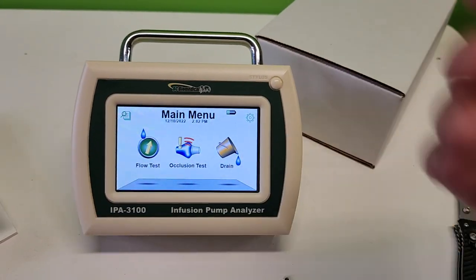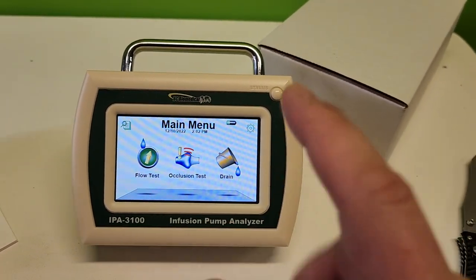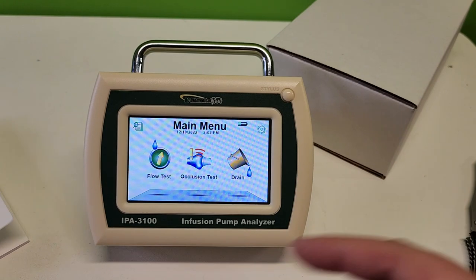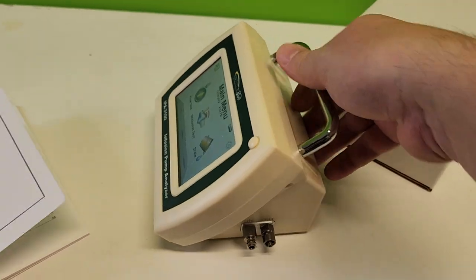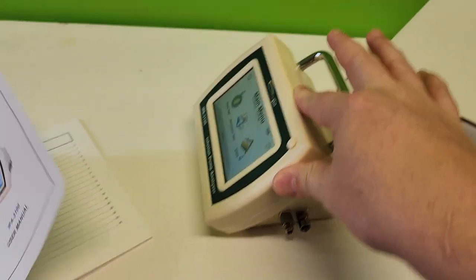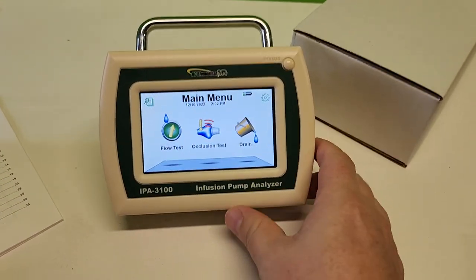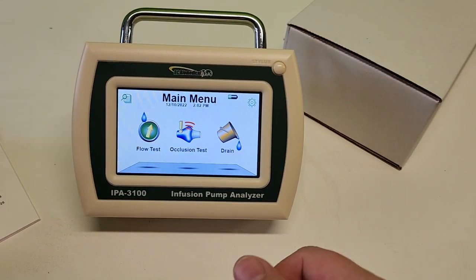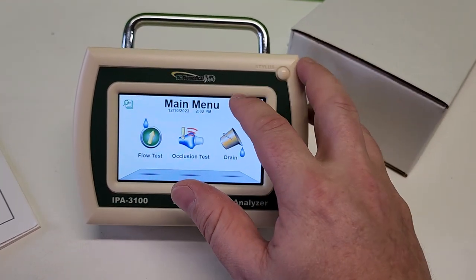My next step is to do a video in the near future where I actually run this through some infusion pump tests. When I test infusion pumps in the field I'm only doing one device at a time, which is why I've always wanted something like this - it's small, extremely portable, and has rubber feet so it stays put. I'm shaking my whole table demonstrating the rubberized feet.